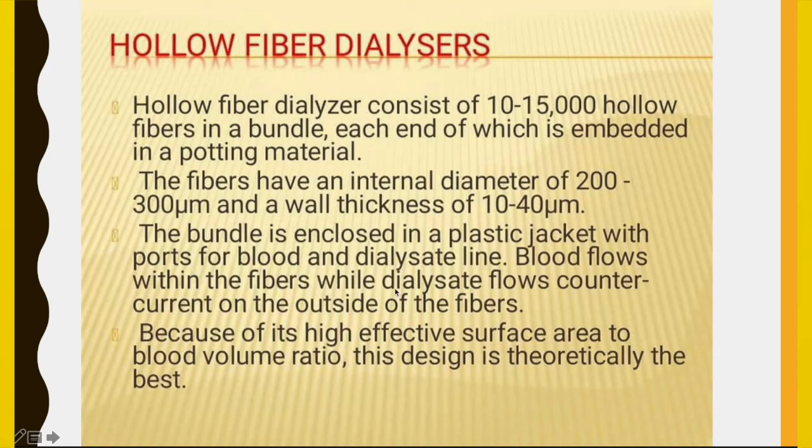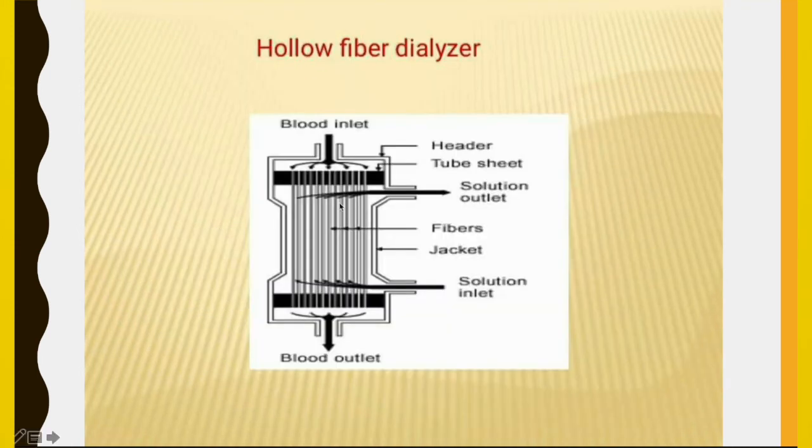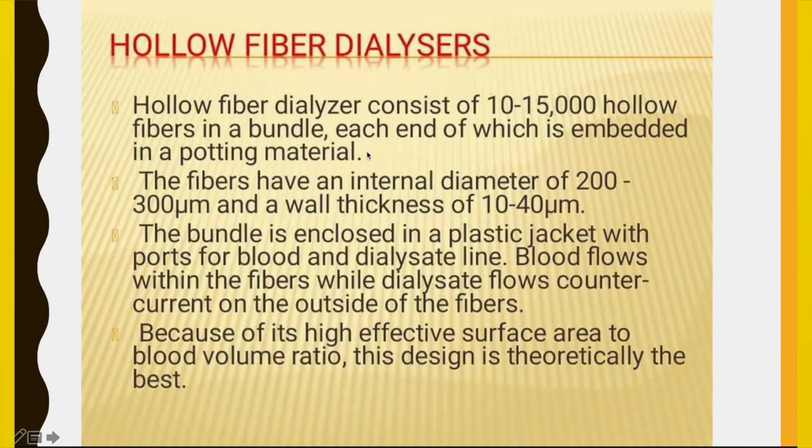Blood flows within the fiber, while the dialysate flows counter current on the outside of the fibers. So the bundle is enclosed in a plastic jacket, and these are mainly thermoset plastic. The second thing is that blood flows within the fibers, while the dialysate flows outside these fibers.